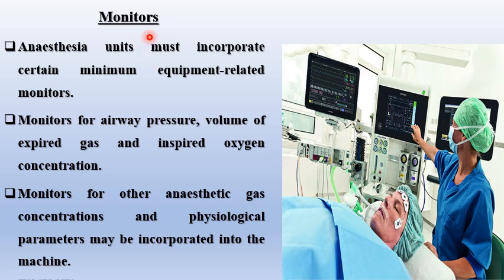Monitors are a very important part of the anesthesia workstation. Anesthesia units must incorporate certain minimum equipment-related monitors. Monitors for airway pressure, volume of expired gas, inspired oxygen concentration, anesthetic gas concentration. Physiological parameters may be incorporated into the machine. So it is connected to the machine.